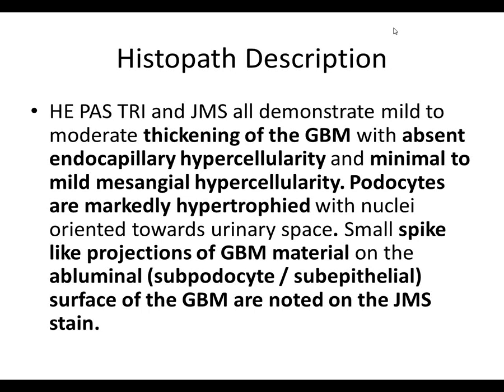I often talk about looking at histology, looking at the podocyte hypertrophy, and with studying with the MDs, they often look at how those nuclei are oriented. If they're really oriented towards the urinary space, with those nuclei almost jumping, it looks like the podocytes are jumping ship, is how they used to joke about it, because the podocytes are really uncomfortable with the fact that there are electron-dense deposits beneath them. And I know that's anthropomorphizing, but it kind of helps everybody remember what's going on.